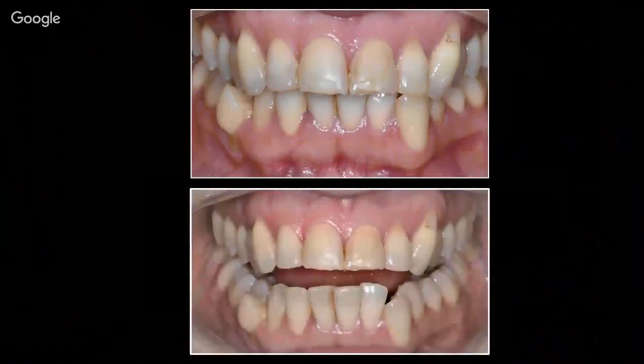So let's go, because as usual, we are late and we have so many things to talk about. So this woman is, for instance, a case where I did a total aesthetic approach. We decided to go for ortho, and only at the end for ceramic veneers.